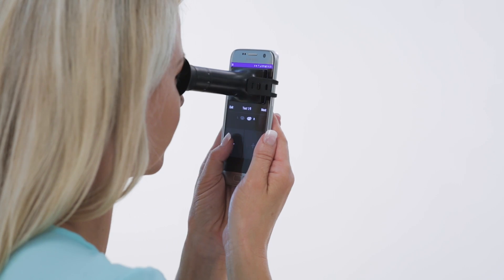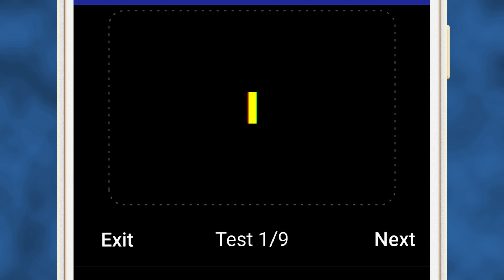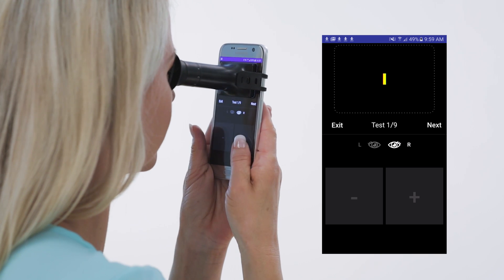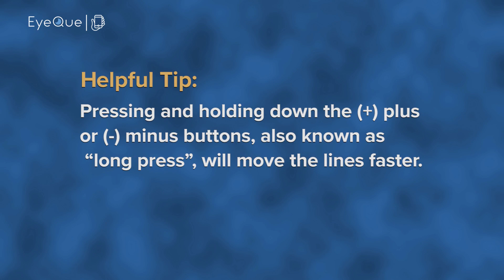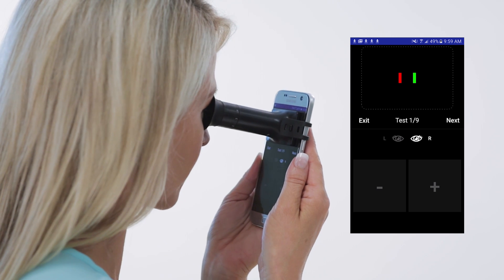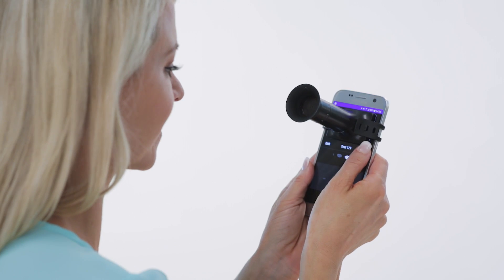Make sure you can clearly see the two vertical red and green lines through the mini-scope. With the mini-scope in position, tap the plus or minus buttons at the bottom of the screen to move the two lines together until they completely overlap to form one yellow-colored line. The minus button moves them closer and the plus farther apart. Pressing and holding down the plus or minus buttons, also known as long press, will move the lines faster. It's important to make sure the two lines completely overlap and create a single yellow line. If at any point you only see one red or one green line, try readjusting your position very slightly. Once you're satisfied that the test lines are accurately fully overlapped, click the Next button.